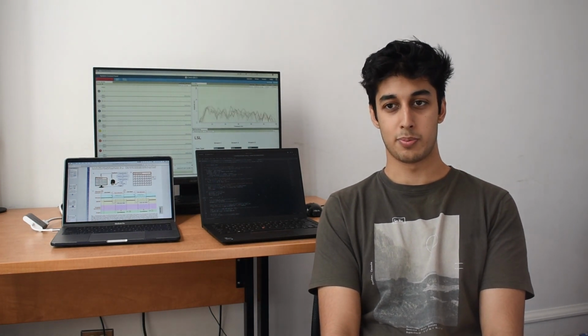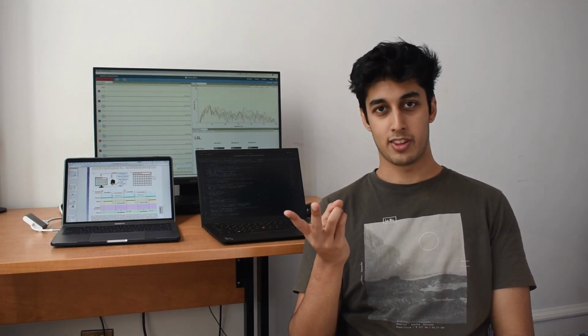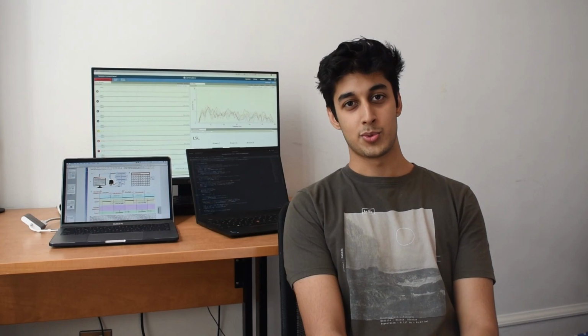Another challenge was inference speed. Since long processing times can severely challenge the rate at which a user can type, we had to make sure that our algorithm could process the data quickly. These factors informed our choice of algorithm. CCA is fast. It's a general method that's independent of the user. It doesn't require calibration, and it worked better in our setting. Once we find the most probable letter, we send it off to the software team.